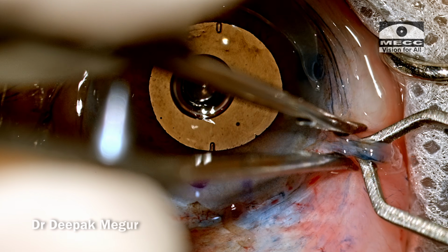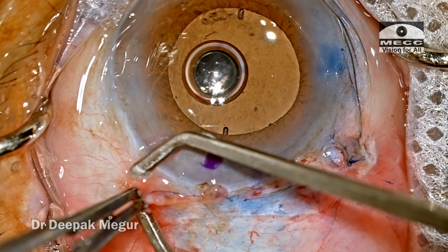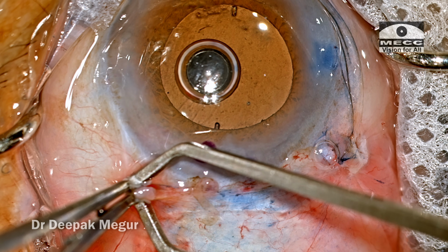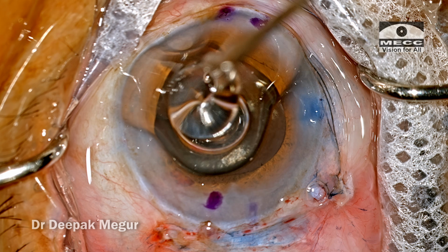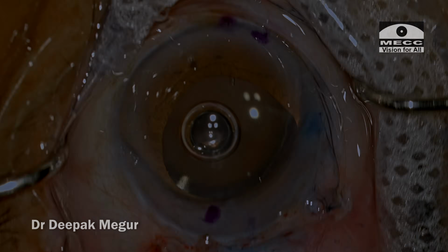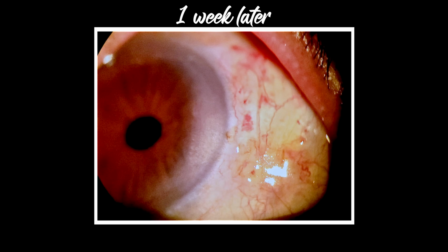Time to close. The conjunctival flap is reposed back, and both the ends of these conjunctival flaps are cauterized so that it sticks well. And that's it, the case is done. So let us see the refraction after 1 week. And this is the post-op picture at 1 week. The patient is doing well.